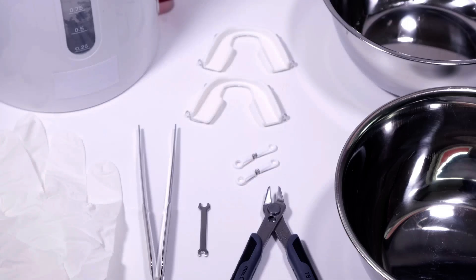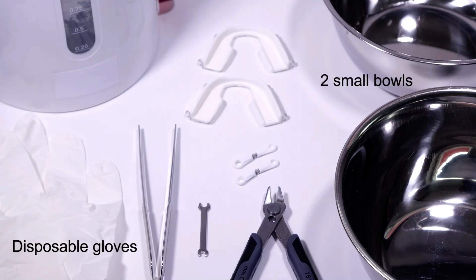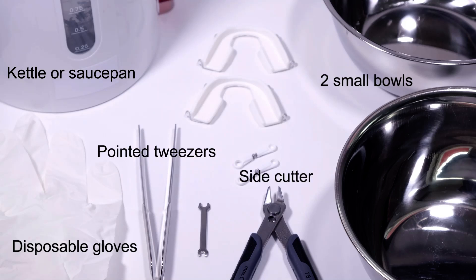You'll need to gather some instruments before you start: disposable gloves — nitrile ones are particularly suitable for the fitting — two small bowls with a minimum base diameter of 10 centimeters, a kettle or saucepan, pointed tweezers, and a side cutter.